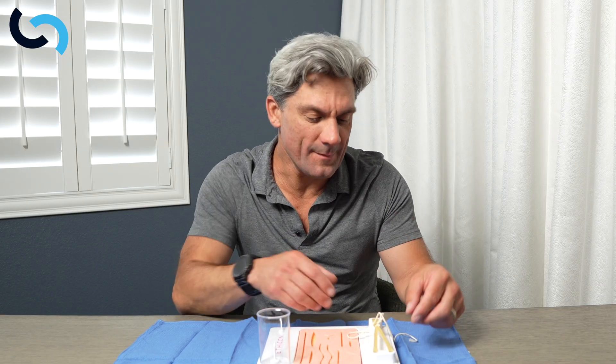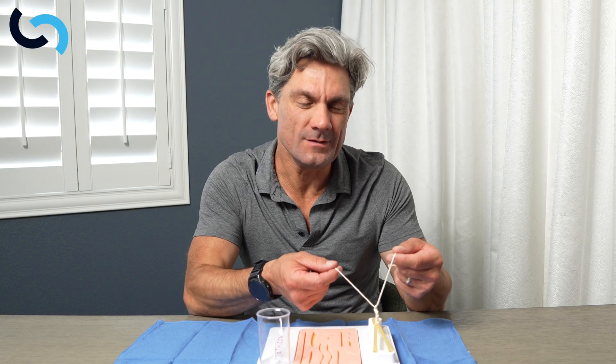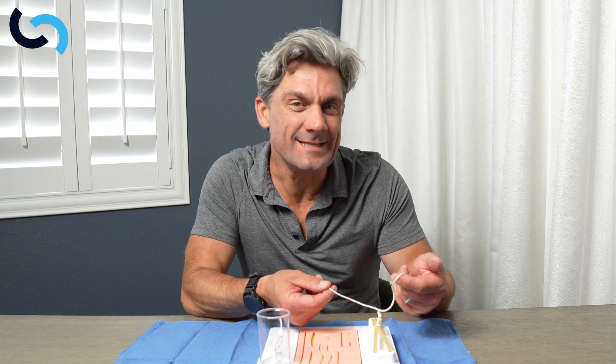I hope that was an easy and straightforward two-handed knot. That is the most important knot to learn how to throw. If you can practice it on a piece of elastic like this, or with a two-by-four with hook screws in an industrial rubber band or even a hair band, you'll have some tension to put that knot onto. Make sure you're not tying air knots. You also want to make sure that you're not lifting up too much — if you lift up, you can tear and traumatize tissues.